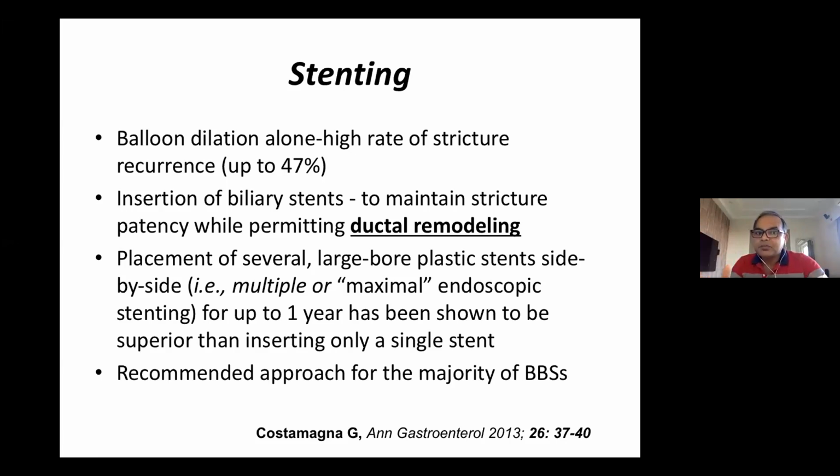And actually they try to place multiple plastic stents. And how much time do they keep them in place? Up to 9 months to 1 year, right? So two things we have learned: multiple plastic stents are better, and they keep them for 1 year, right?